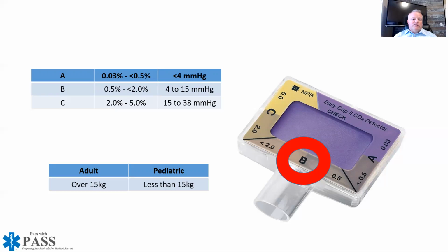Don't use the wrong size cap because it will make your child hypercarbic, which is a high level of CO2 in the blood, and that is going to end up causing other problems downstream. So I wanted to point that out.